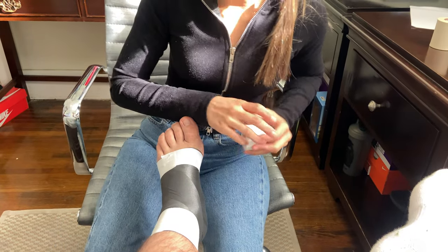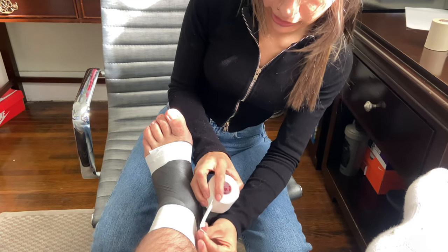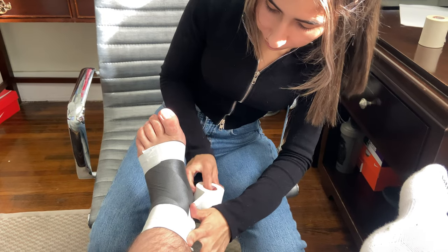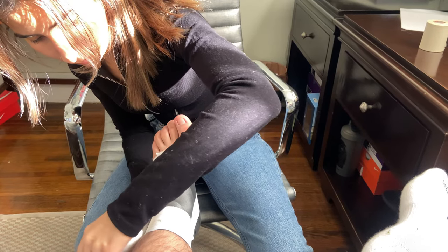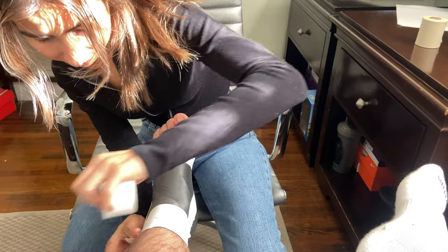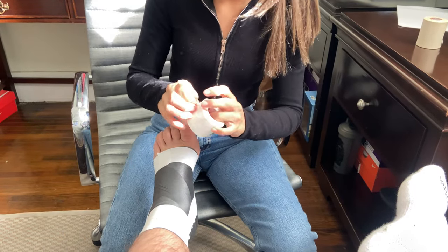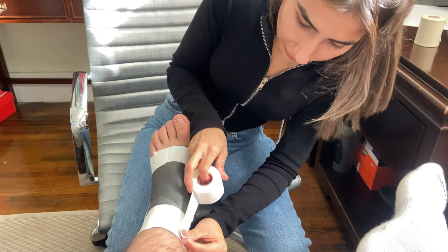So now we're going to go ahead and apply stirrups from medial to lateral and anchor the stirrup. We want to apply three so that way we create that basket weave appearance.